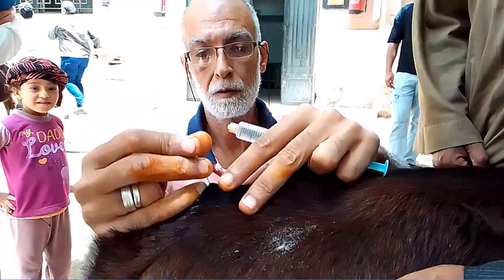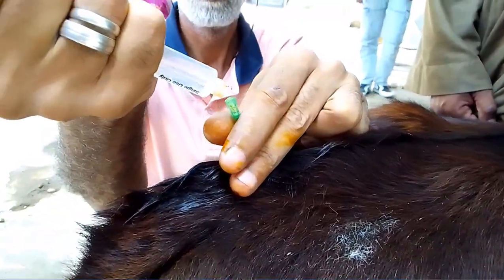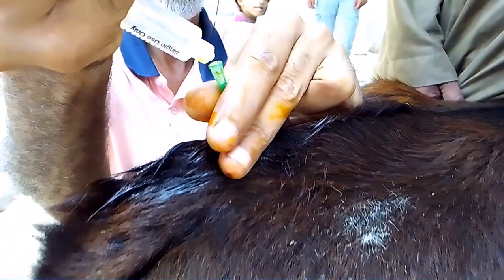Epidural analgesia is performed by inserting the needle at the sacrococcygeal space or first intercoccygeal space. Watch the suction in the hub of the needle that indicates that the tip of the needle is in the right place.